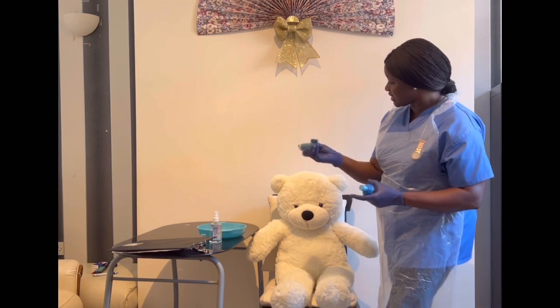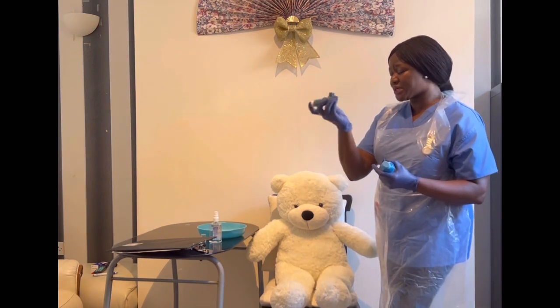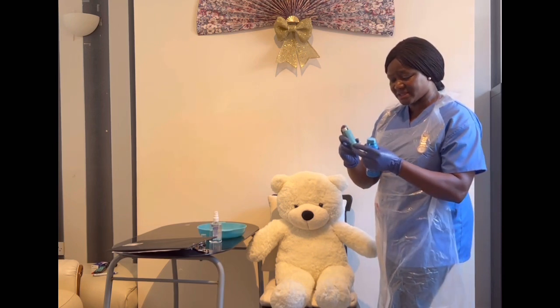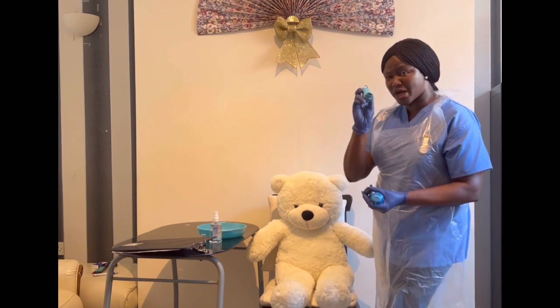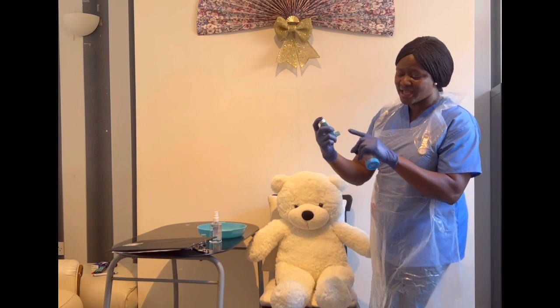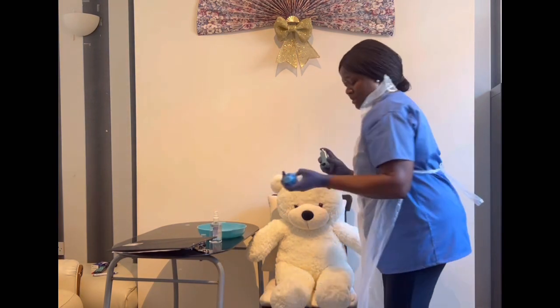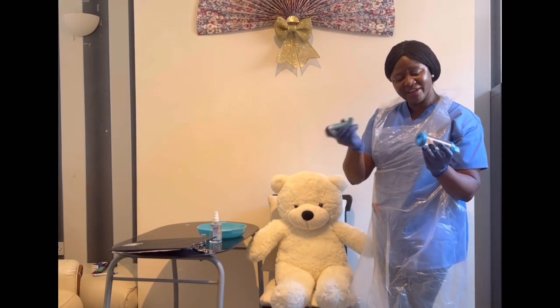I'm going to shake the pressurized metered dose inhaler for 3 to 5 seconds to make sure the medication is well mixed. I'm removing the cap from the mouthpiece of the inhaler, and I'm checking that it's clean and there's nothing hidden in the mouthpiece. So I've shaken it for 3 to 5 seconds.